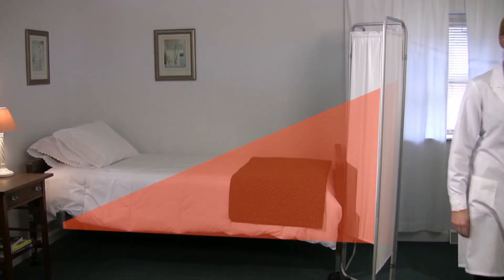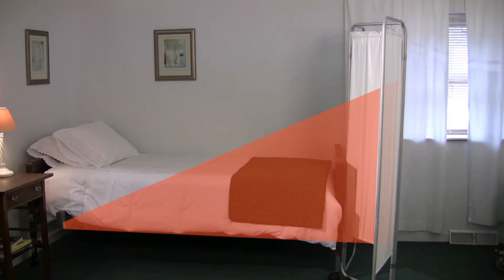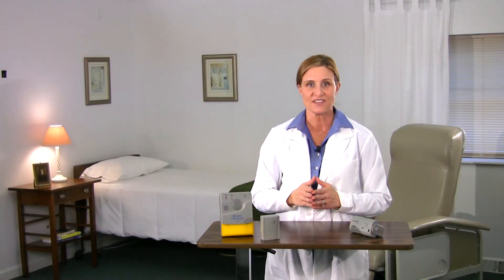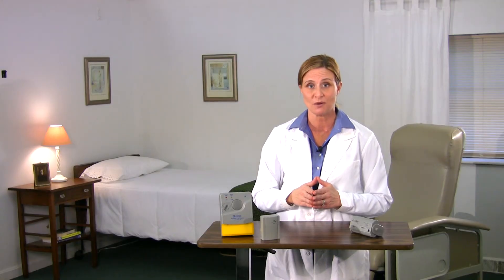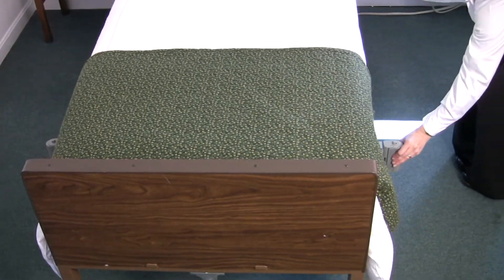The PIR unit's sensor field extends horizontally up to 24 feet from the unit. In order to prevent false alarms caused by the caregiver or other patients, use a privacy curtain to reduce the area the sensing field covers. Ideally, face the alarm near the foot of the bed so the sensor field stops at the wall and does not trigger a false alarm if someone walks past the foot of the bed. You may choose to use a second PIR unit to ensure proper coverage — for example, if a PIR is placed on one side of the bed, you may need another for the other side.